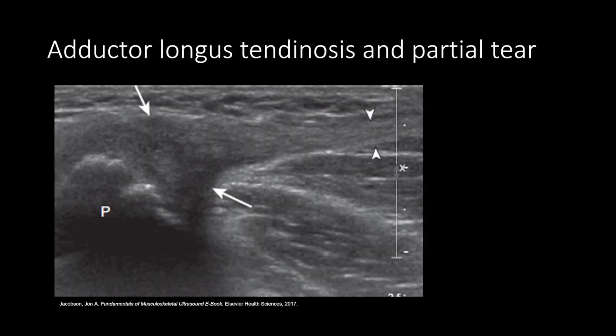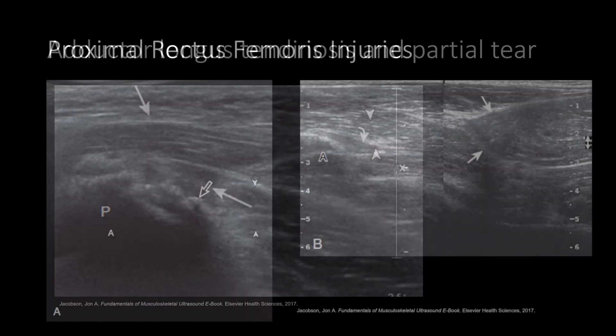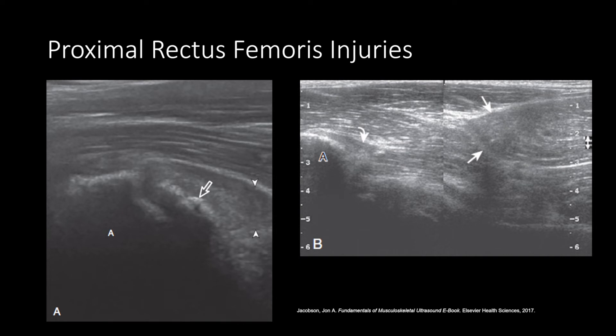This is a long axis view of the adductor longus tendon with tendinosis and interstitial tears. The arrowheads show normal distal adductor tendon. Here on the left image, this shows a long axis view of the direct head of the rectus femoris with cortical avulsion at the open arrow from the anterior inferior iliac spine. The right image shows a full thickness tear of the rectus femoris, denoted by the arrows, that is retracted from the origin denoted by the curved arrow.